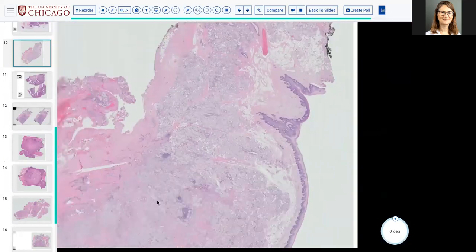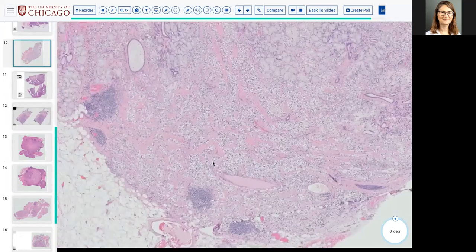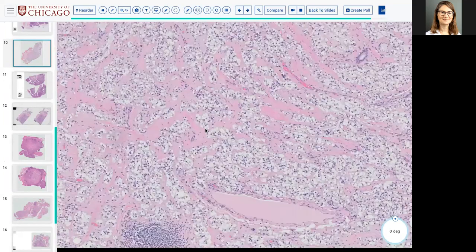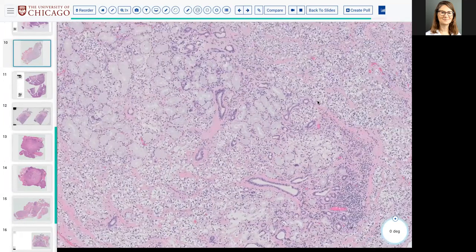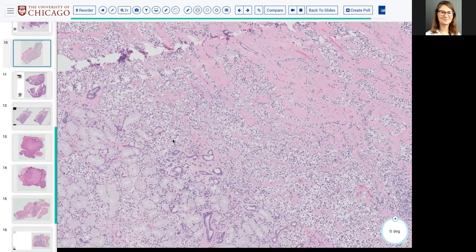The two things about clear cell are what do they stain like and what are their genetics? Are we sure it's not an RCC? Yeah, we can make sure it's not an RCC by doing a squamous profile and a Pax8. Exactly. So these stain like squamous, so they have high molecular weight keratin and P40, P63. They do not have any of the other myoepithelial markers like SMA or calponin or GFAP. They do not have those, right? So they basically are isolated squamous cell markers.